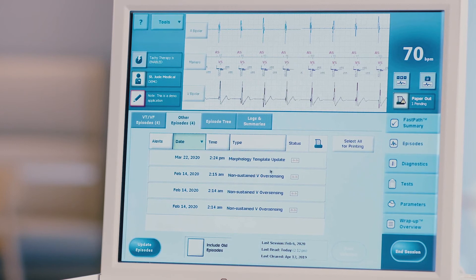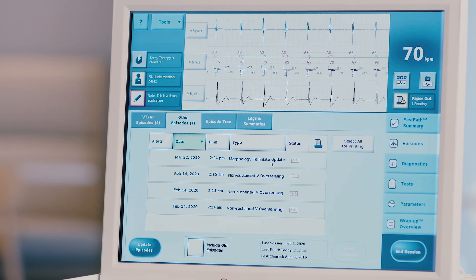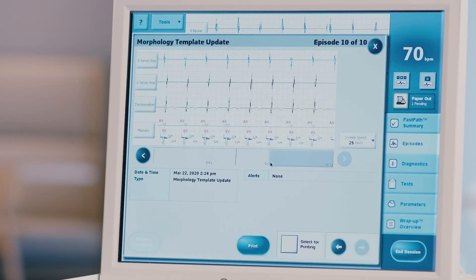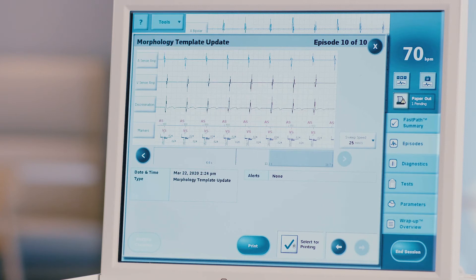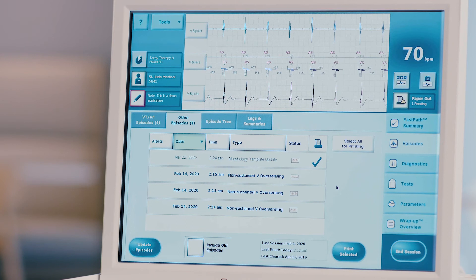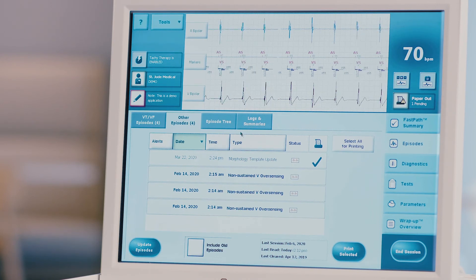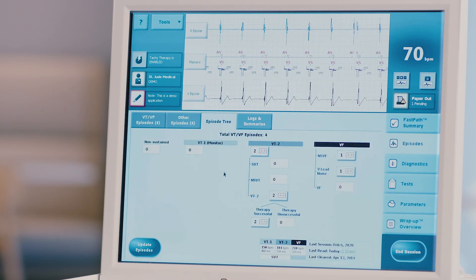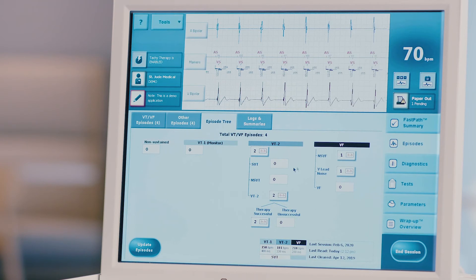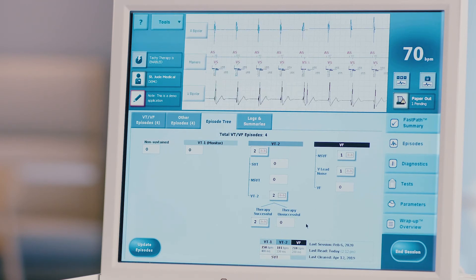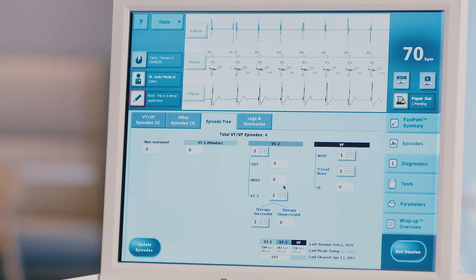Any episode that has an accompanying recorded EGM will be noted by this icon. Choose the episode to be evaluated by clicking on it in the list. The stored EGM will open on the screen and include all relevant episode data: date, time, duration, and type. You can choose to print this episode now by pressing the blue print button, or select it for printing later by checking the select episode for printing box. Press X to close the screen. Note that certain episodes will be pre-selected for printing. Repeat these steps for all relevant episodes. Press the episode tree tab for a graphic summary of new tachycardia episodes, showing the number of episodes in each detection zone, therapy delivered, and whether therapy was successful. Stored EGMs can be viewed from this screen by pressing the EGM icon.